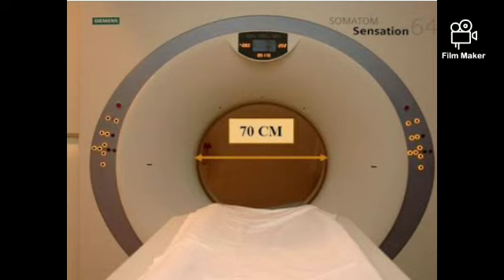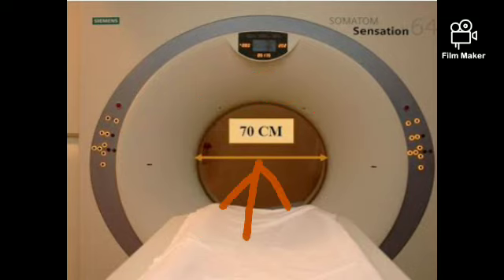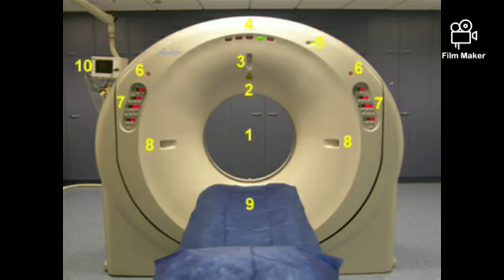First you have to know this is a CT scan gantry. Okay, the circular one like a donut shape, and this gantry is around 70 centimeters. Next thing, you can see here a bisection point, and this is known as the isocenter. Next we will move on to the parts which we see from the external view of the gantry. So number one is the isocenter. For every scan you have to place the patient at the isocenter midpoint.